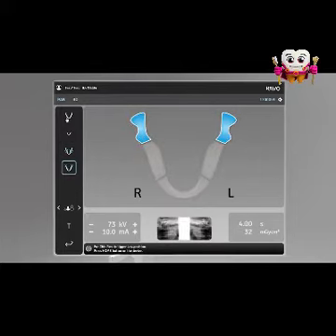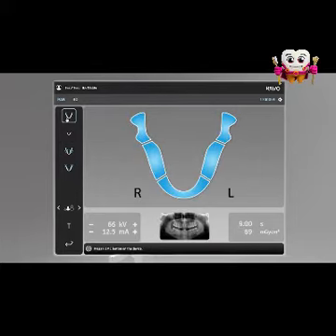The Standard Panoramic Imaging Program provides a general view of dental and facial anatomy, typically seen for adolescents and adults. The Pediatric Panoramic Imaging Program is normally used for pediatric patients. It uses less radiation dose and a smaller imaging area than a standard panoramic image. Adult patients with an exceptionally narrow jaw can also be imaged with this program.